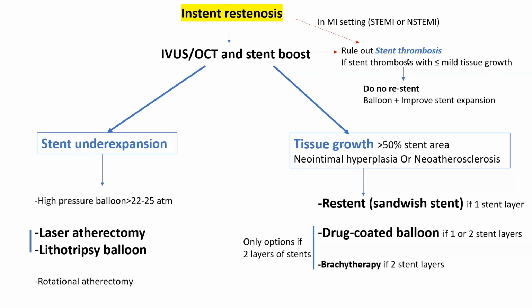So that's what you need to do with stent thrombosis. Do not restent. So the only time we restent in this slide is if you have in-stent tissue growth inside one stent layer. That's really where you restent. In none of the other isolated scenarios do you restent.